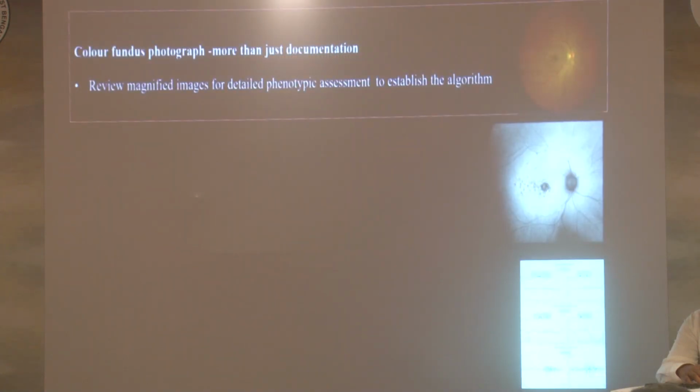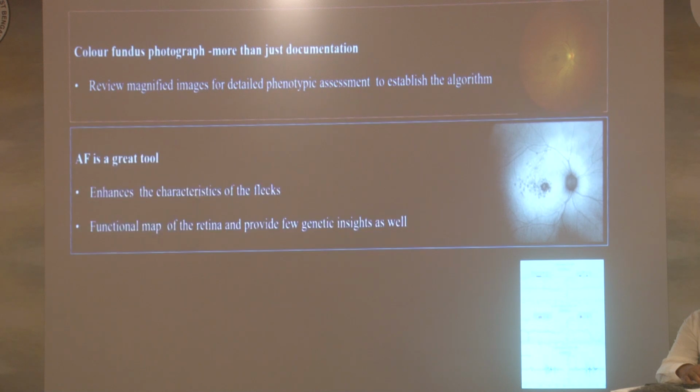Coming to the discussion, so fundus photograph is more than just for documentation. These images can be reviewed for a detailed phenotypic assessment at a later date. Autofluorescence is a great tool because it enhances the characteristics of the flecks and acts as a functional map and gives some genetic insights as well.